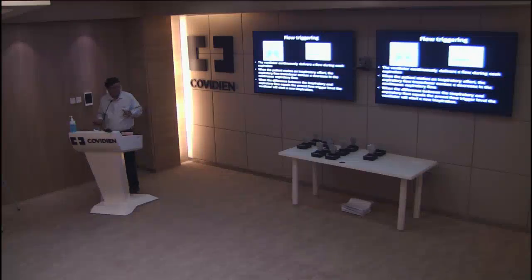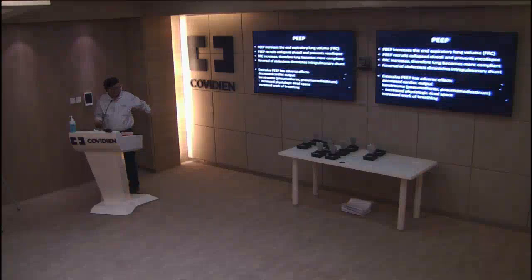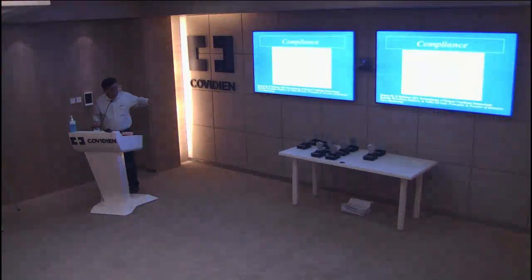This should be optimal. PEEP, you all know about PEEP, and I'm sure you'll be told about how to ventilate. Basically, it's like a balloon, we all know that. Initially, when you're opening up a balloon, it takes some time. But once a certain amount of air has filled the balloon, then it becomes much easier to blow the balloon. So PEEP just does that. It increases the initial functional residual capacity so that the compliance of the lung improves. That's the main thing with PEEP. So it moves the lung tidal volume to the more compliant area of the pressure volume curve.